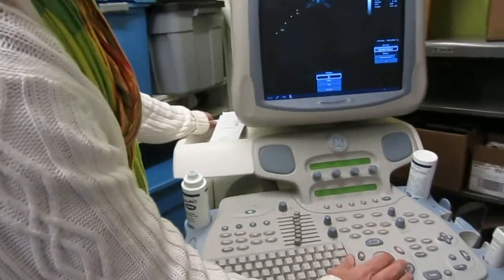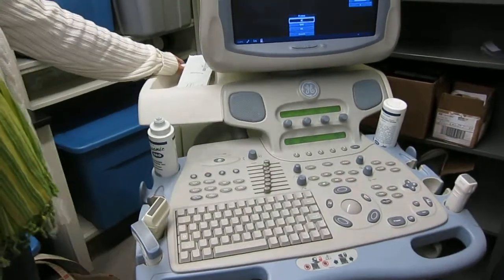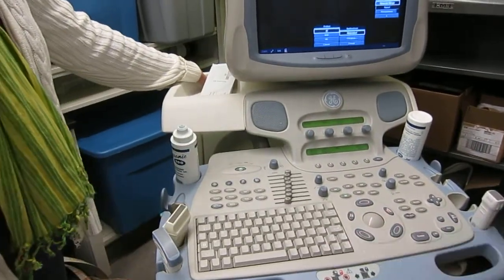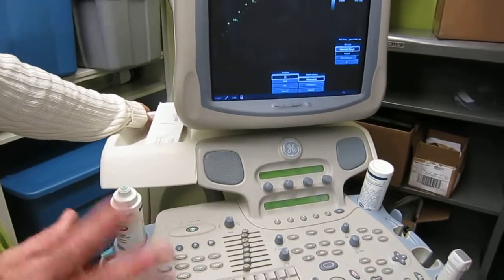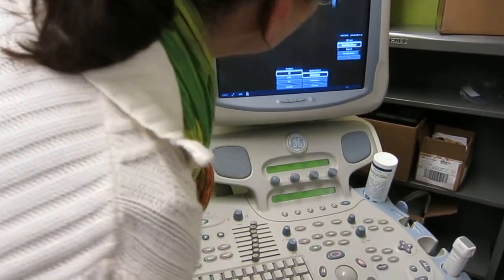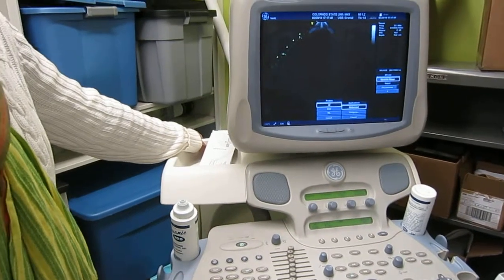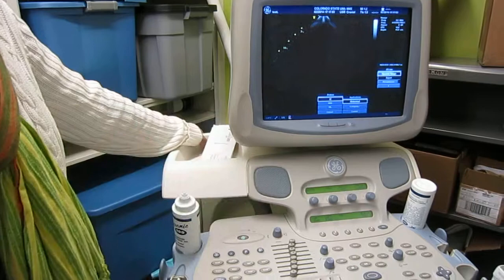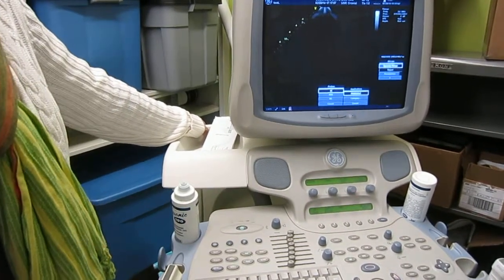All right. So let's see. We're going to hook up the 4C first. And so go ahead. Somebody push the set button. That's the one we want. So you just push any of the set buttons for it. Okay, and it automatically defaults to an abdominal study, okay, which is what you want. Well, if you're going to do carotids, we're hooking this up. These are made for abdominal or anything but the heart. Okay, so push that set button again.